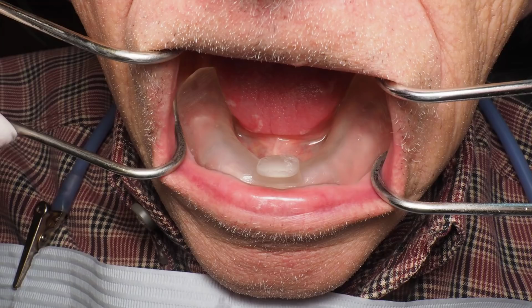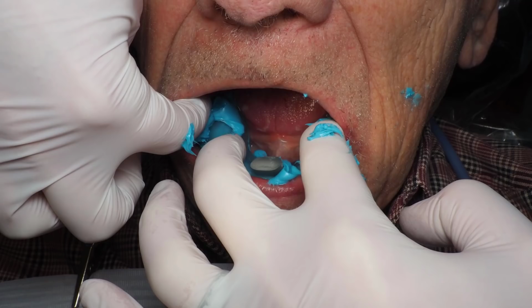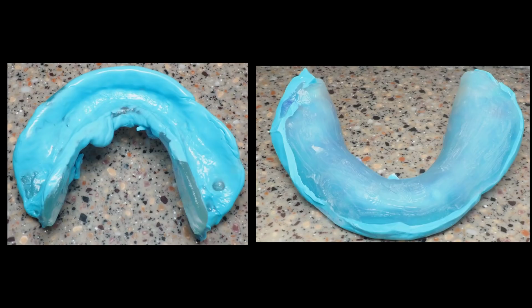So here's the patient. He came in with a very old existing upper denture. He had lost the lower denture. So what was done was that the upper was used as a bite rim. Essentially, we did a reline impression inside of that. And then for the lower, a custom impression tray was made and used to do an impression. As you can see here, that's being done in the mouth, and this is the resulting impression.